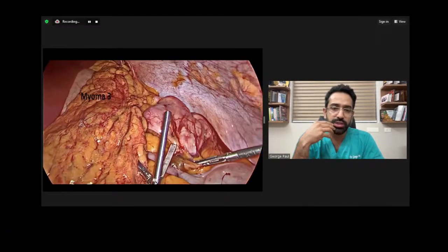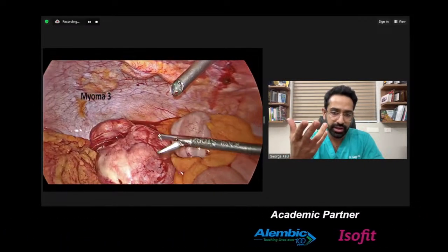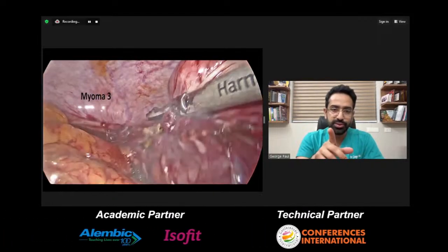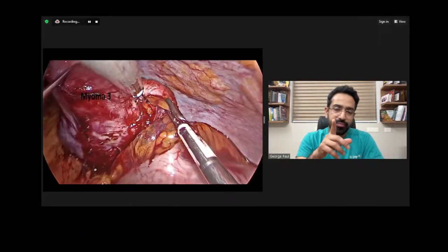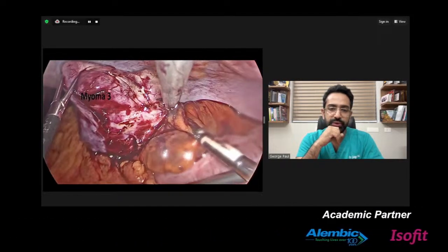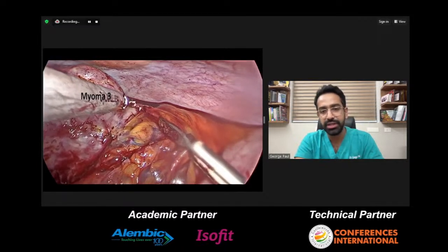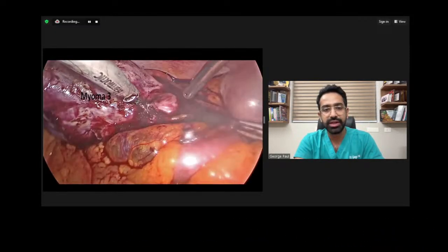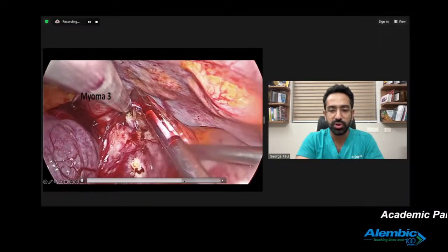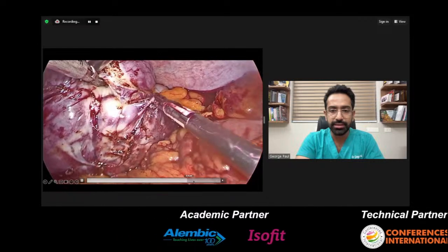So this was towards the liver side, taking vascularity and attachment from the omentum and the transverse colon. So these ones are quite dangerous usually because of the vascularity. I'll show you another video also where we had a difficulty in doing that. But this was again, you have to take your time and dissect it carefully, coagulate the vascular areas, and then separate it from the transverse colon. So that was the third myoma, dissected that.